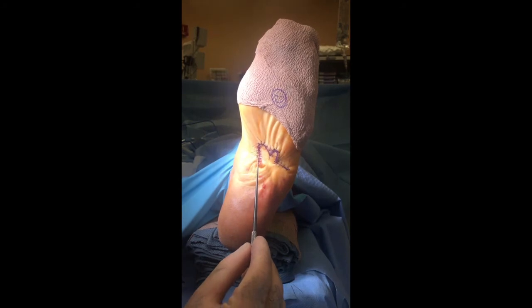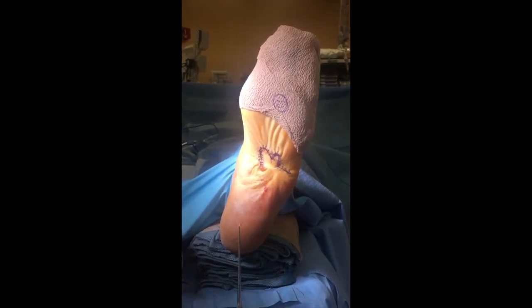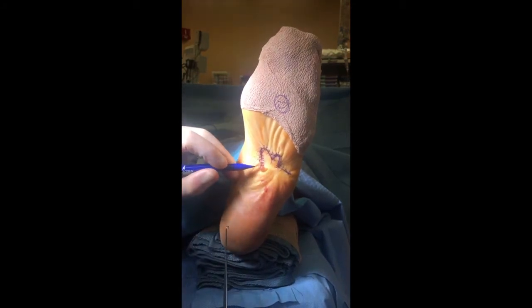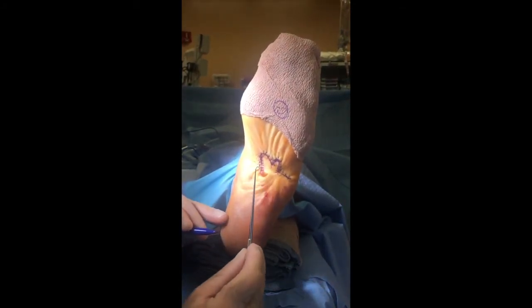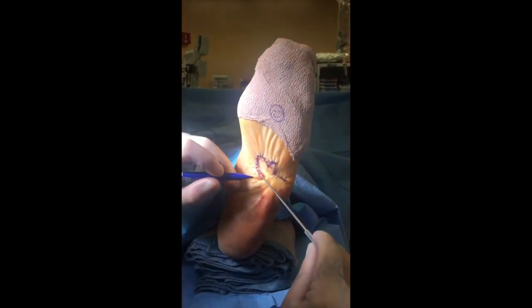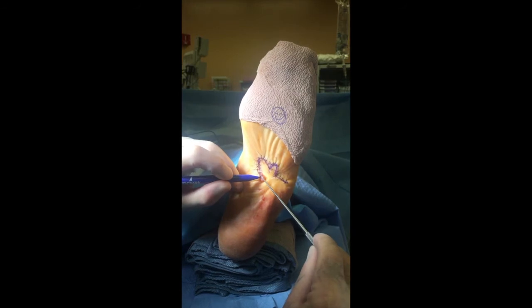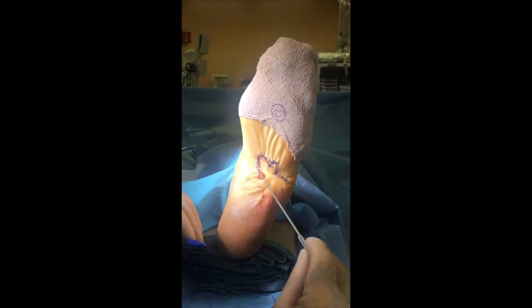You want to come off that line at a 45-degree angle — you can go almost either side, but you want to avoid coming into the base of the flap. So we're going to cut it on the side away from the base. With a single prong skin hook, grab the base, pull it over, and make an incision about 45 degrees off the main incision line.